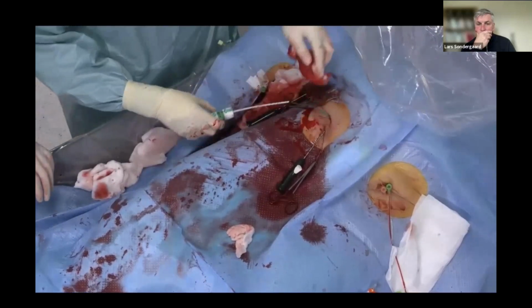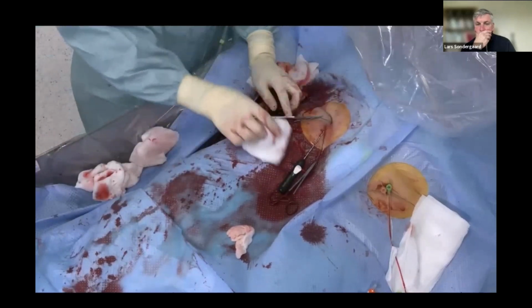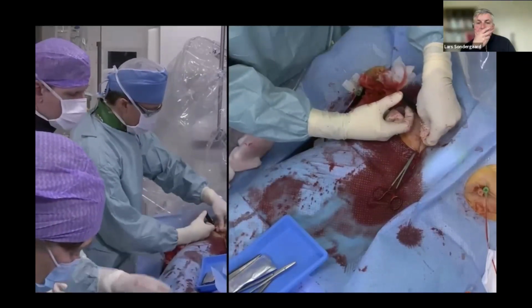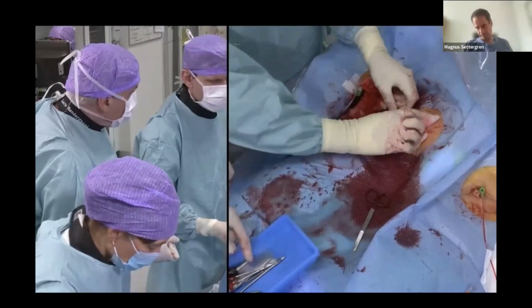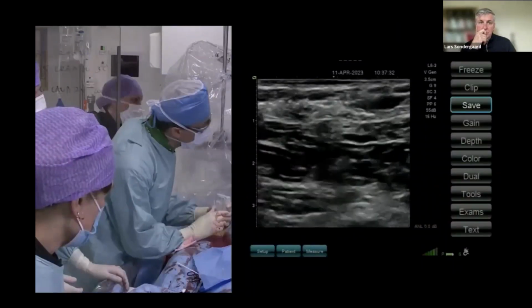So yeah, we put an AngioSeal, and indeed now externally at least we have complete full hemostasis. So now we don't need to compress anything. I mean, we have no bleeding now. We're sure that it's not going to bleed, but of course we also make sure that we have a patent vessel. So we can maybe demonstrate, Gintas, with ultrasound how to check that flow in that vessel here. So let's get the ultrasound probe then.